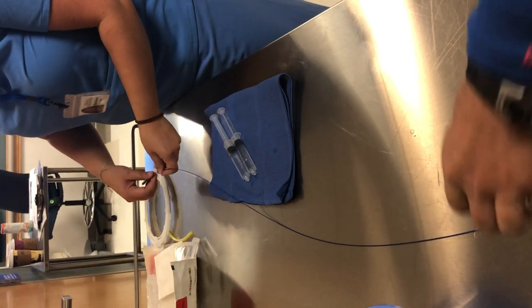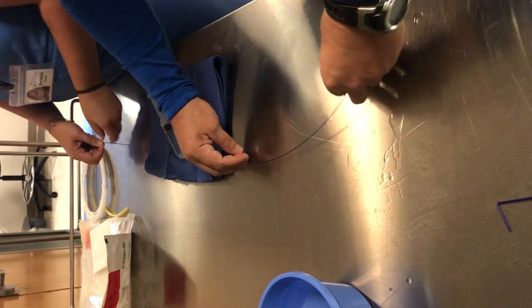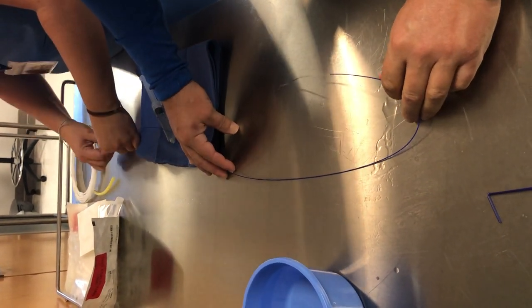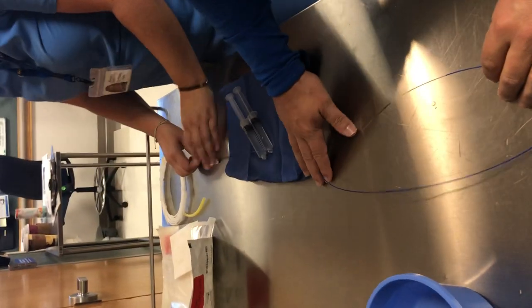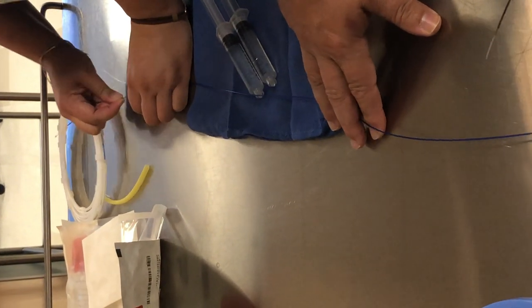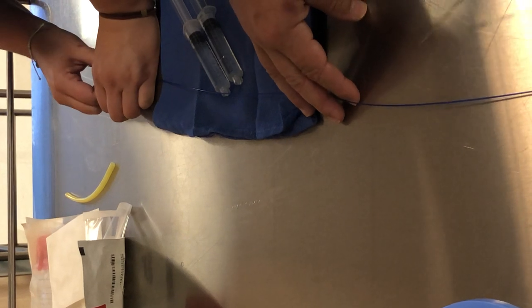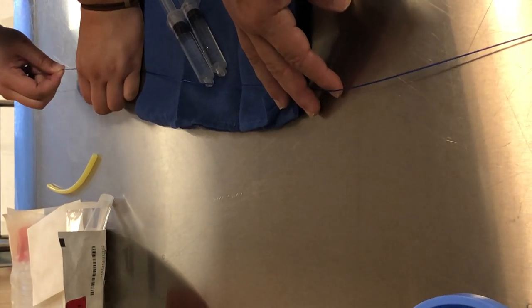Let's say you're in the body now. You want the torque device up close so you're pinning this in the body and pulling this back. You want your torquer right up on the tip. Then we pull this back.